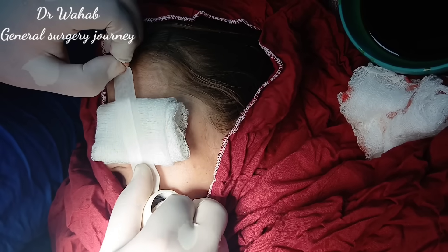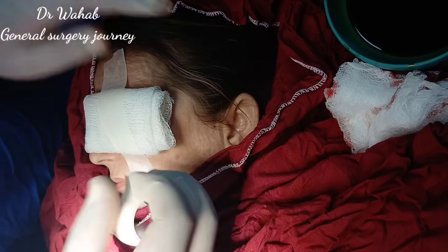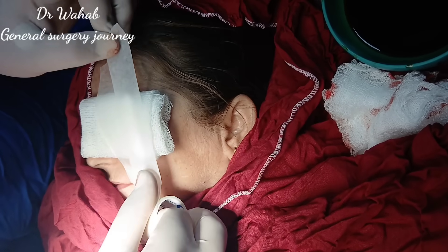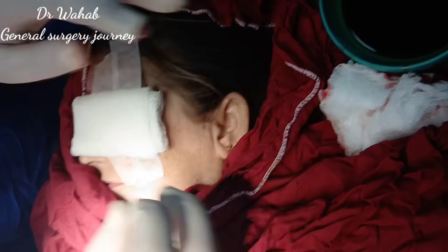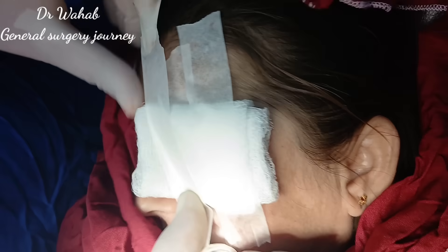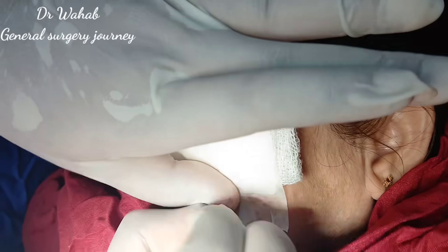Now we will apply a sterile dressing. The patient is advised on routine post-operative care including cold compresses, antibiotic ointments, and follow-up for suture removal after 5-7 days.